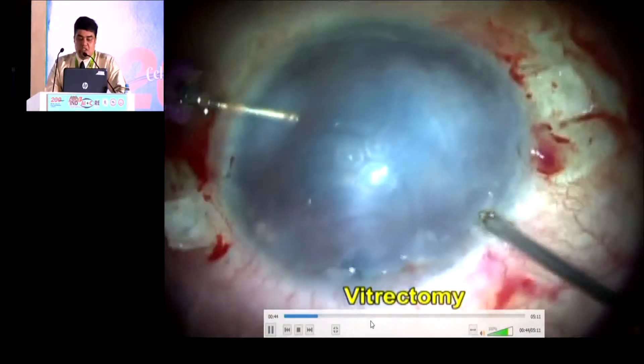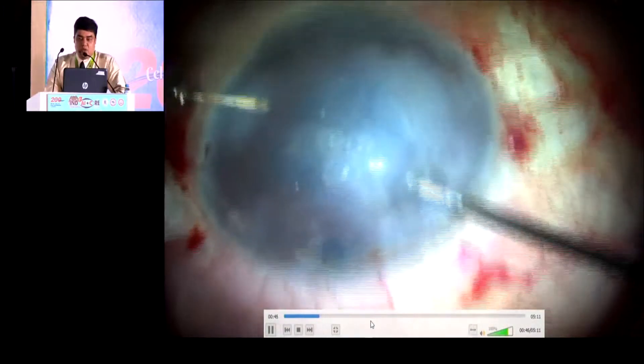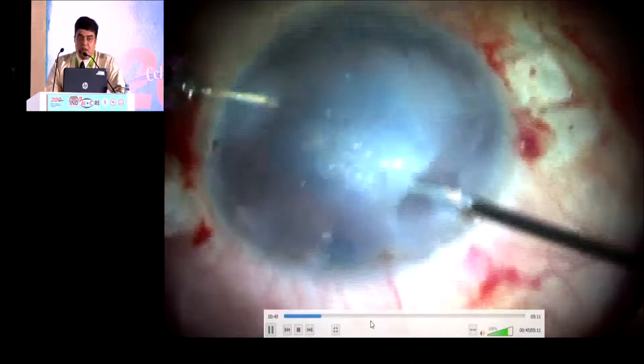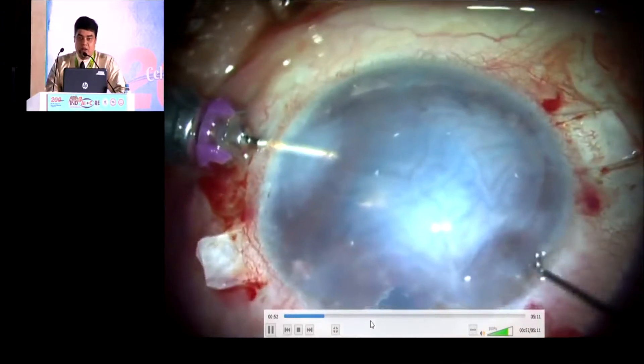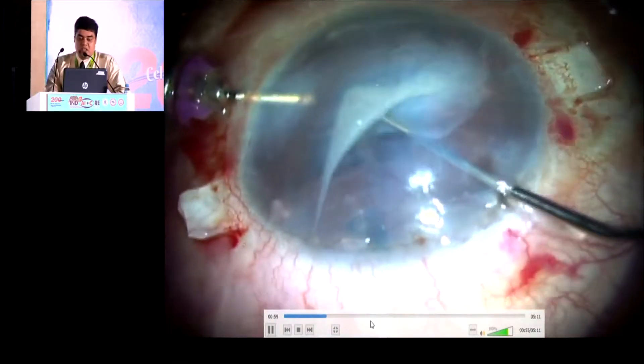As the visualization is very poor, we are trying to use the endo-illuminator and trying to do a thorough anterior vitrectomy and trying to separate the vitreous strands in the AC.